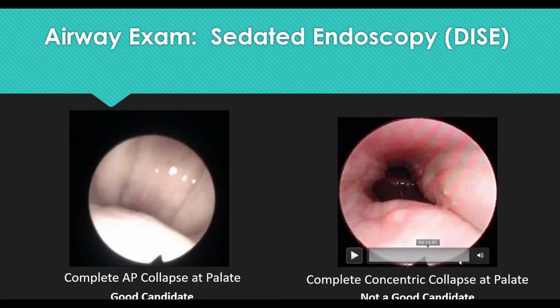And rarely we will have patients who have a UPPP or significant weight loss, and they'll come back to us and they'll be AP. But it's hard to tell somebody immediately post-procedure, guess what? I know you really wanted this device. You're not going to get it. So we try and tell them instead, not now. You're not a candidate right now, but let's see what we can do to make your apnea better, and then come back to that. Very good advice.